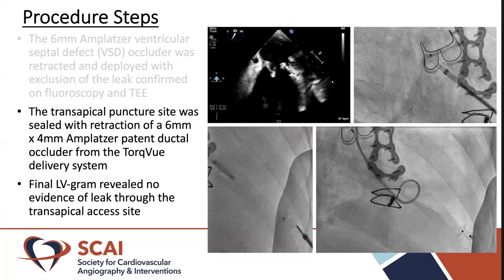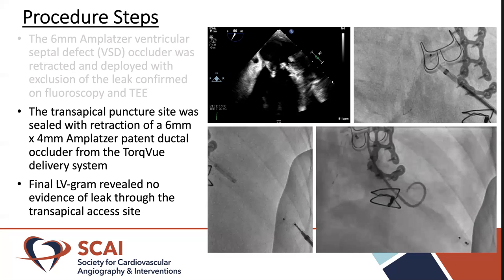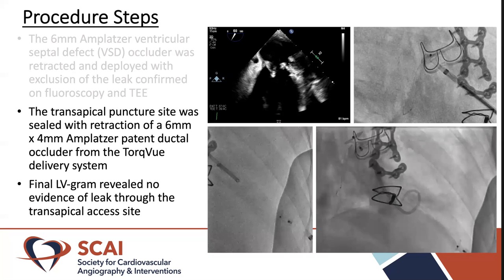Finally, we released the device. And after releasing the device, we then performed an LV gram to confirm that there was no evidence of extravasation of contrast or blood outside of the device.